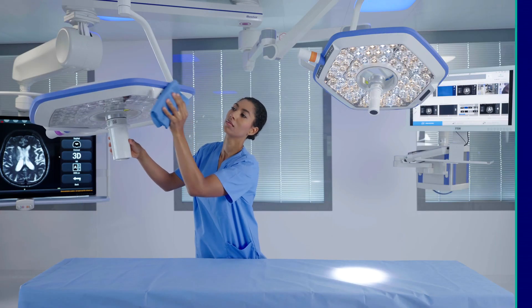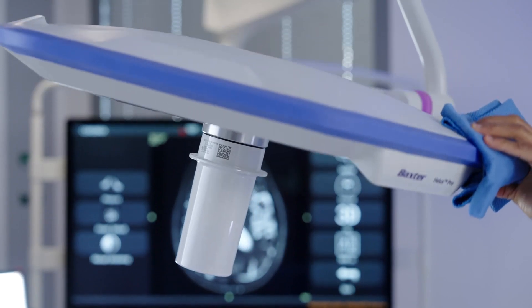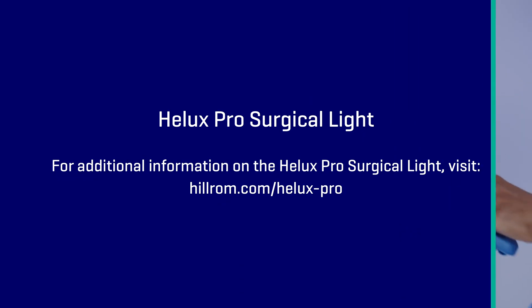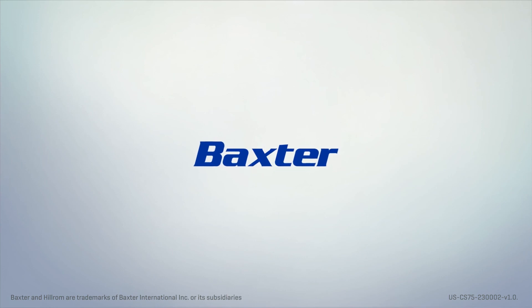To properly clean and disinfect the light, please use approved cleaners. Refer to the user manual for complete cleaning instructions. For more information, please contact your local Baxter representative or visit our website to learn more. Thank you.